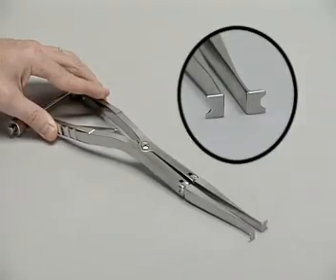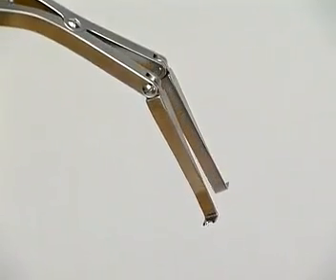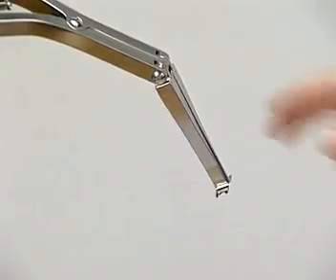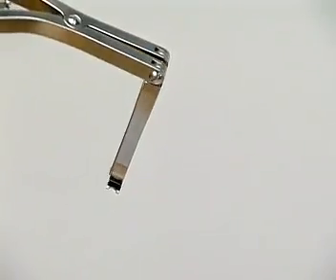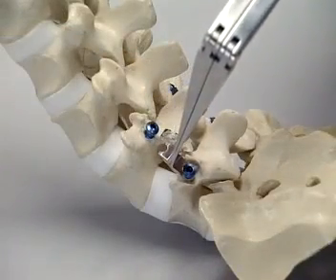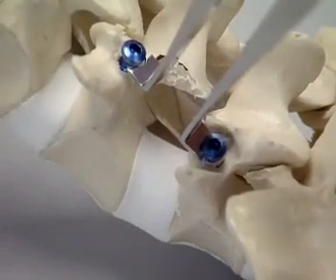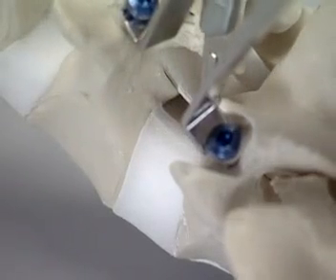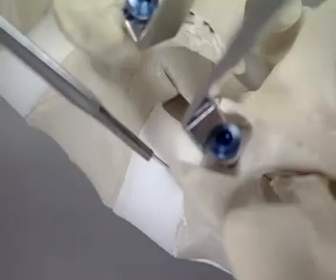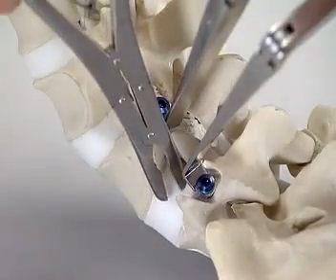Distraction is achieved by pressing the handles together. The end of the distractor can be adjusted to the required position. The tips of the distractor are placed over the Cliquex screws and the appropriate distraction is applied. With the scalpel, a window is cut in the disc, and the disc material is removed using a rongeur.